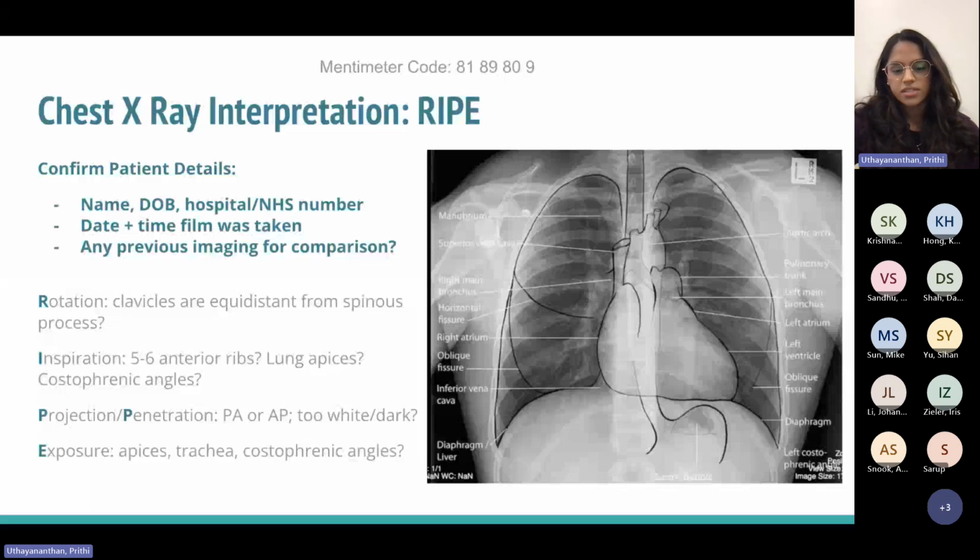One other thing, in terms of anatomy, you'll remember in second year or first year, the lungs are divided up into lobes, but in an X-ray, it's not always easy to see the different lobes. So what we do is divide it into 3 segments: the upper zone, middle zone, and lower zone. And that's how you locate where you can see opacifications. So for example, you might say there's consolidation in the left middle zone instead of lobe.